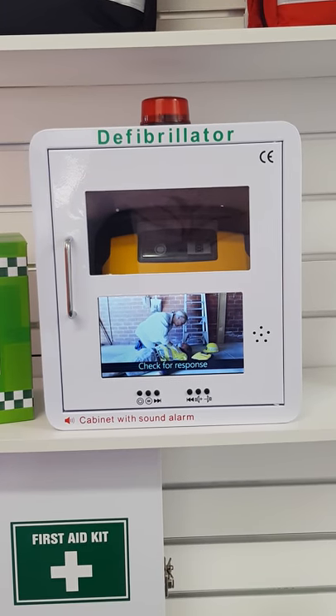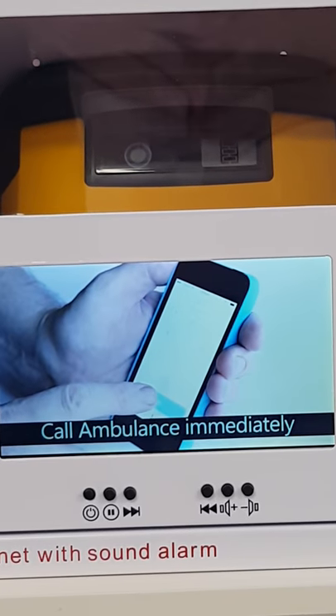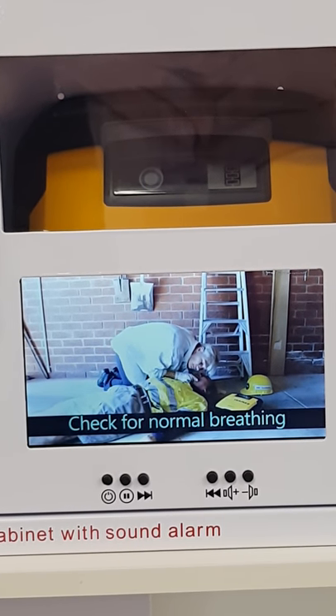Touch and talk to the patient. If no response, call or send for help immediately. Check the airway, open the airway and check for breathing.